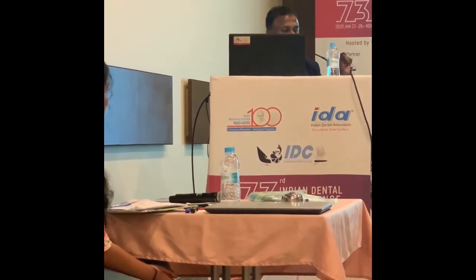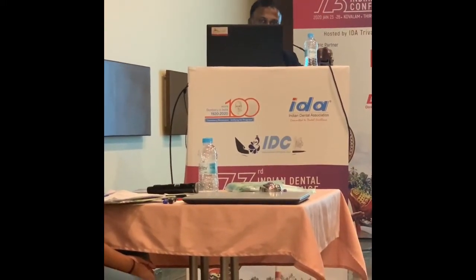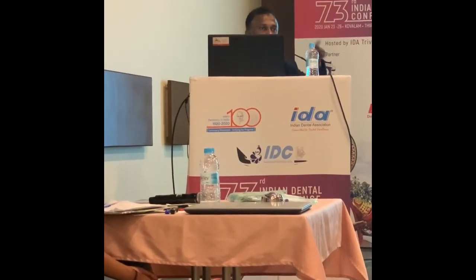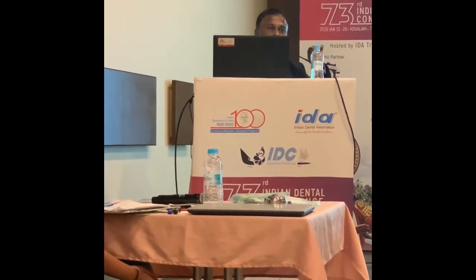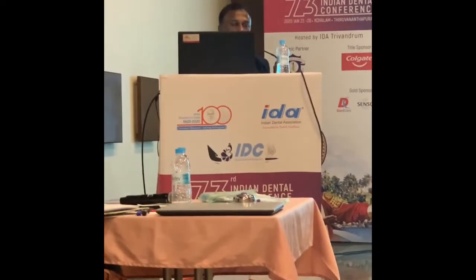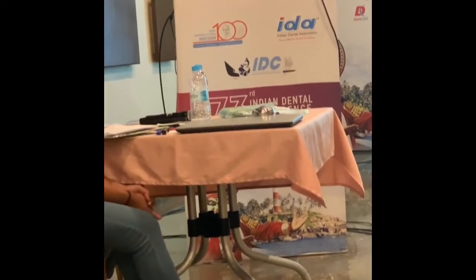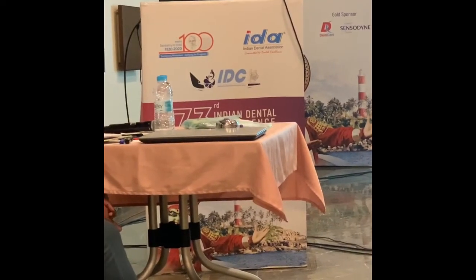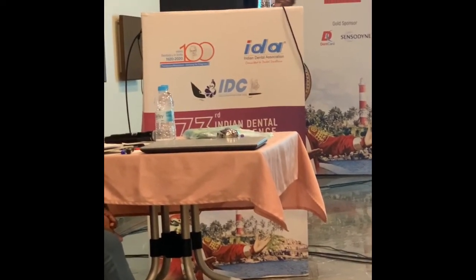And then when these 4 implants are made to project outside straight, that is when you add the abutment, and now you can connect a metal framework above and the teeth are placed above. The advantage of using a metal framework is that you can increase the ridge height, and you can remove the screws and service it also. See, when the patient spends a lot of money on the implant, you should be able to address the complaints as and when required. Just like I told you, you do scaling yearly once or so, removing the calculus; you have to do service for the implants also.